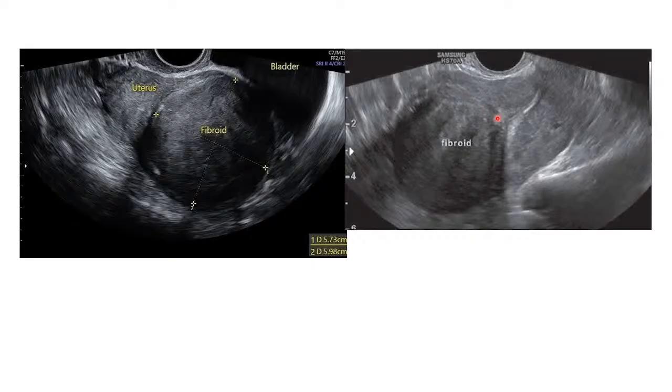Again, if you look here, you can see that's the uterus. Then this is the cervix. You can see the cervical canal there. Then this is the body of the uterus, and you've got another huge fibroid, the Venetian blinds. These lines that you are seeing here, this is what we call the Venetian blinds. This is a fibroid, the whole of that. It's a well outlined fibroid.